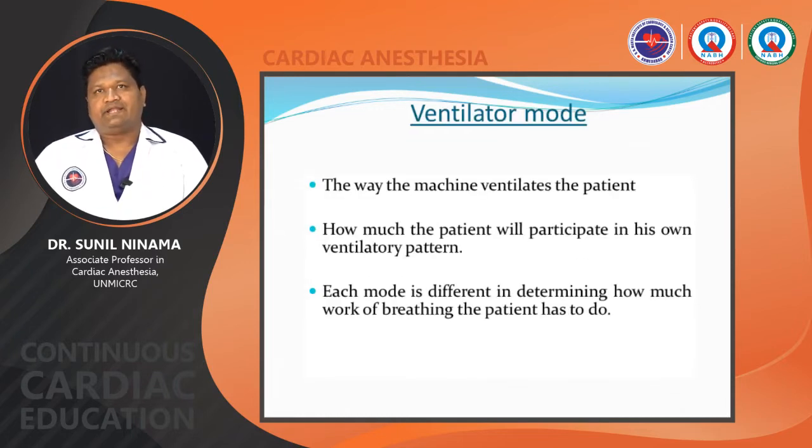What do you mean by ventilator mode? It is the way the machine ventilates the patient and how much the patient will participate in his own ventilatory pattern. Again, each mode is different in determining how much work of breathing the patient has to do.